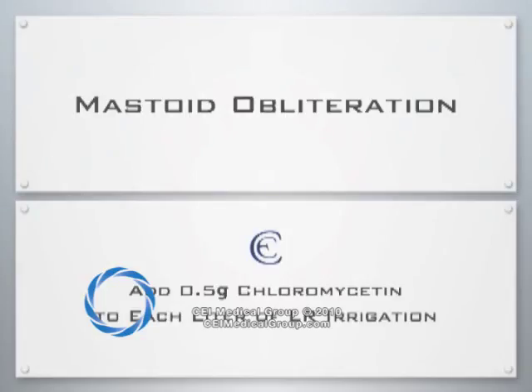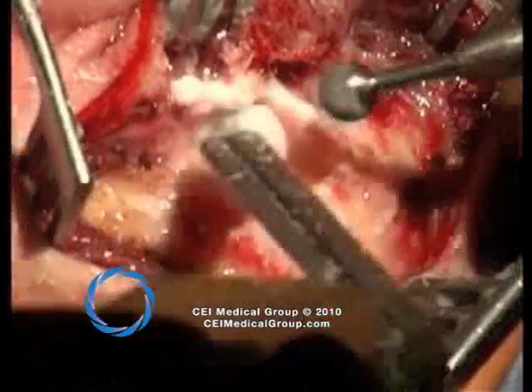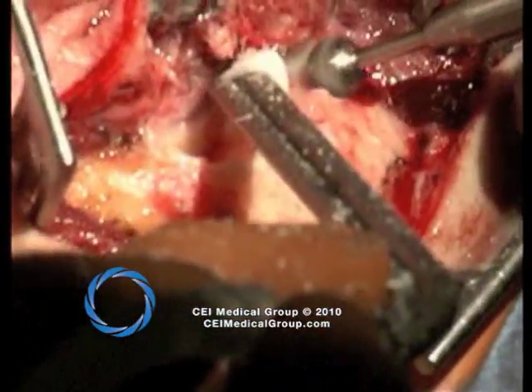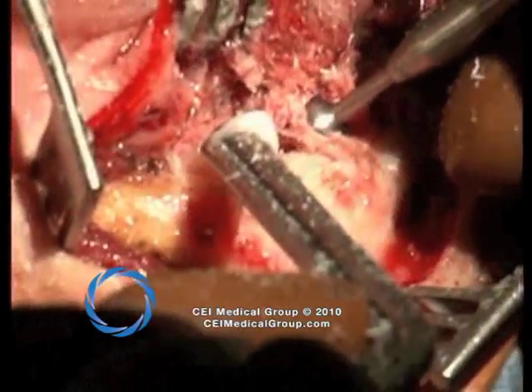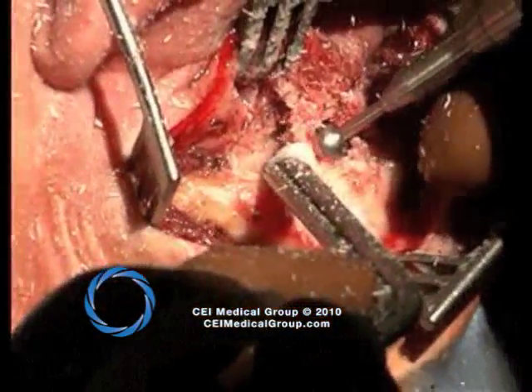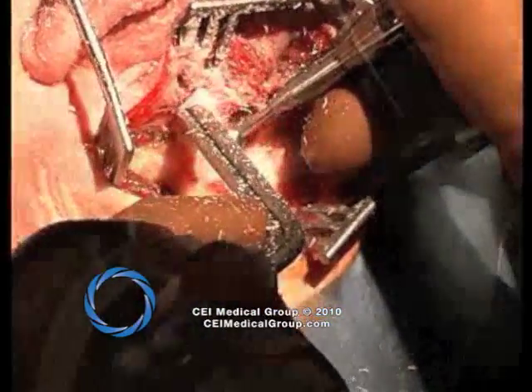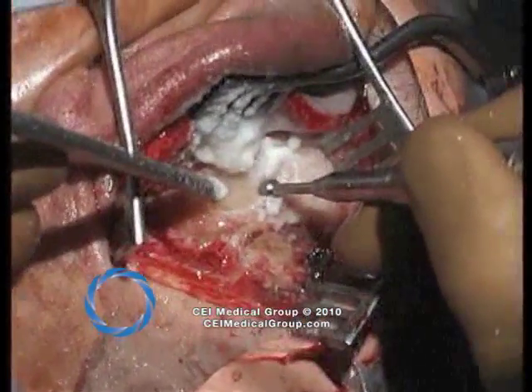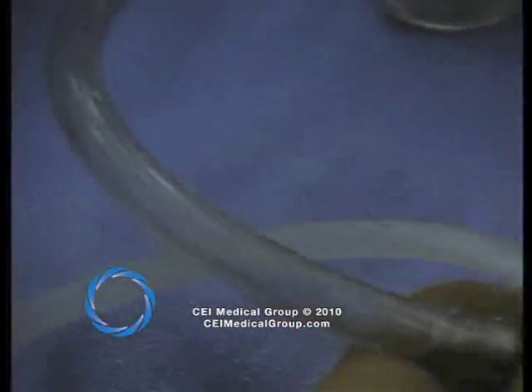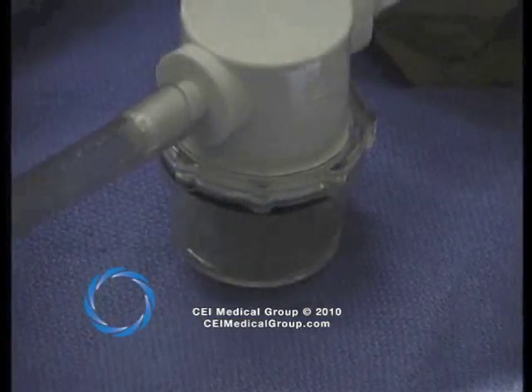During the drilling, it is absolutely critical that a half gram of chloromycetin be added to the irrigation itself. Here you see a 6mm burr harvesting bone from the temporoparietal and mastoid cortex. The suction irrigation in the left hand is attached to the bone pate collector. The chloromycetin-laced solution is irrigated through the bone pate. In a second example, a 4mm cutting burr is utilized to take pate of finer quality. Here you see the bone chips coming into the pate collector and being trapped within the screen.